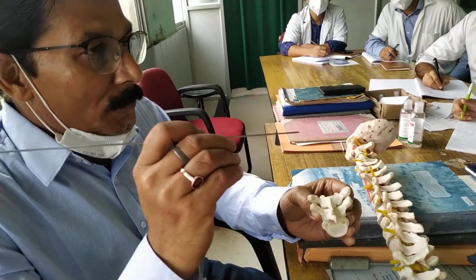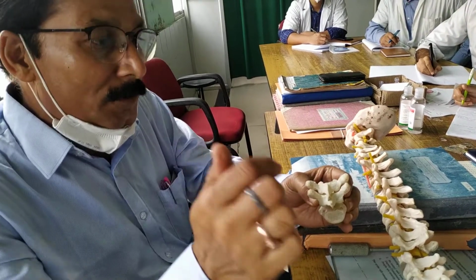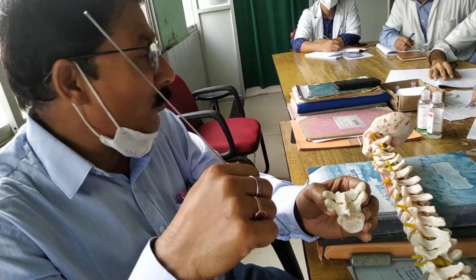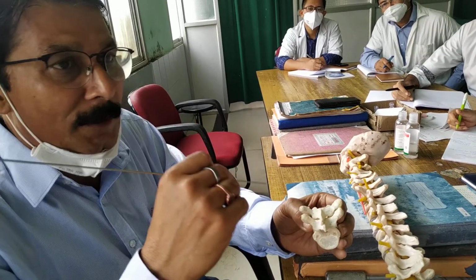And as I said, while you are doing the dissection, your feeling of the cautery should always be touching something hard, not soft tissue. So if something soft is intervening in between, that means something is wrong. You are not going to do the dissection. You have to be careful.